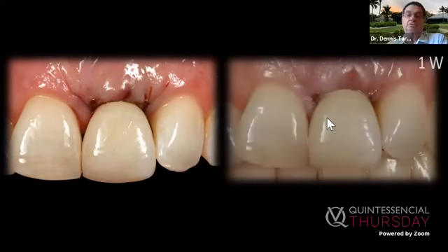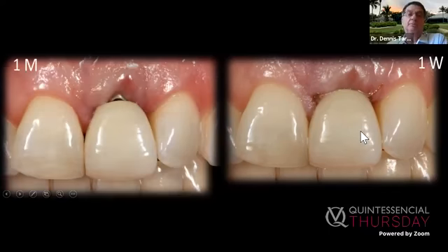And there's the extra tissue at 1 week. Now it's going to move up a bit. Now this tissue was thick, so it came down, except for the hole. And we had the hole here, so it's not going to cover a hole. But this is a bonded bridge.